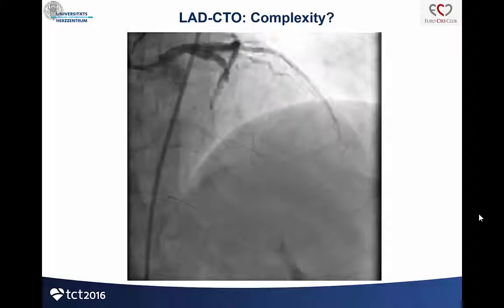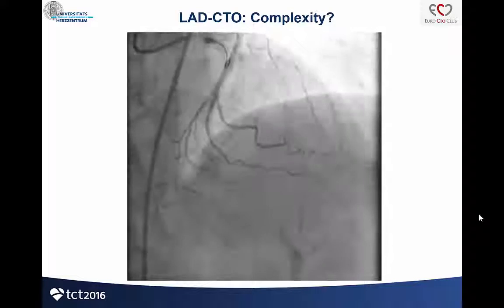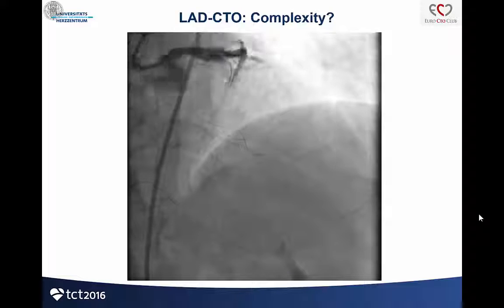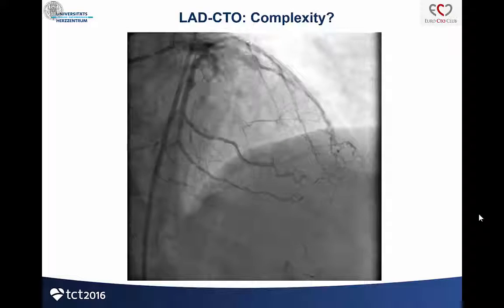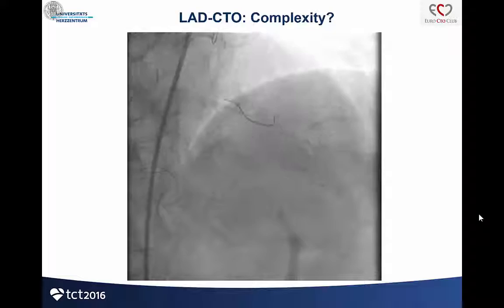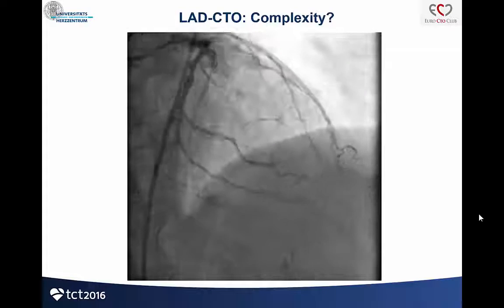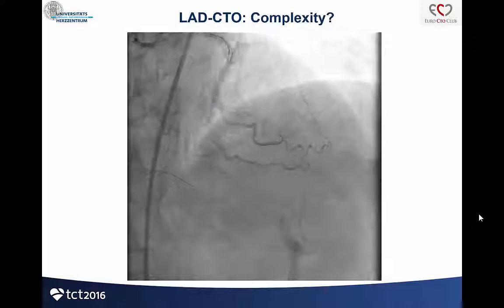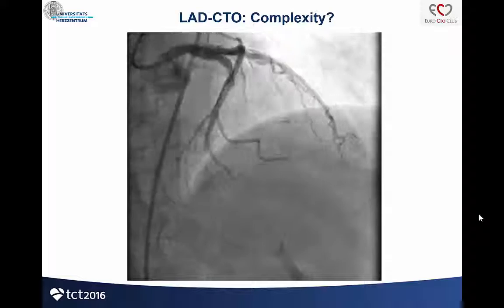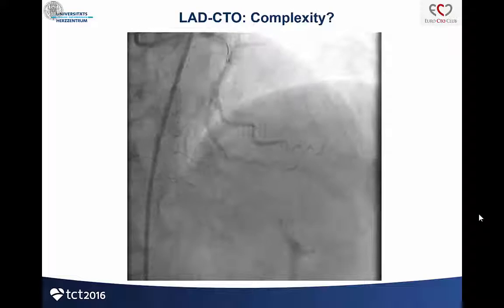So I stopped my retrograde approach from the right coronary artery. As you can see here, the LAD is really a complex CTO. We have a blunt stump, a 30-millimeter calcified lesion, and the landing zone is not very nice.